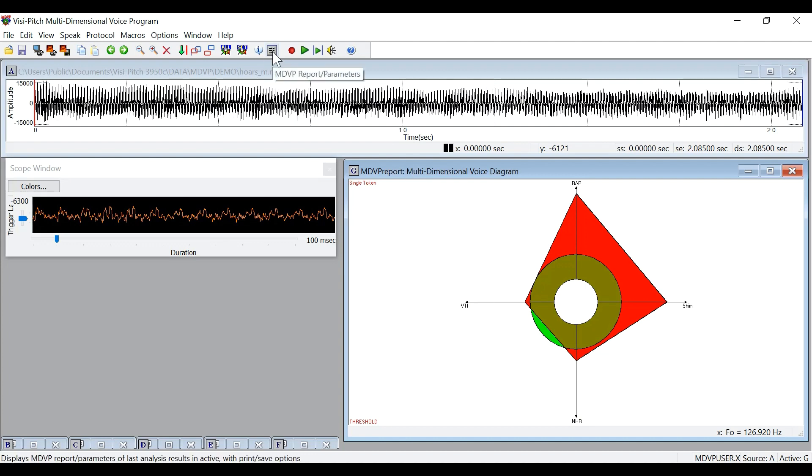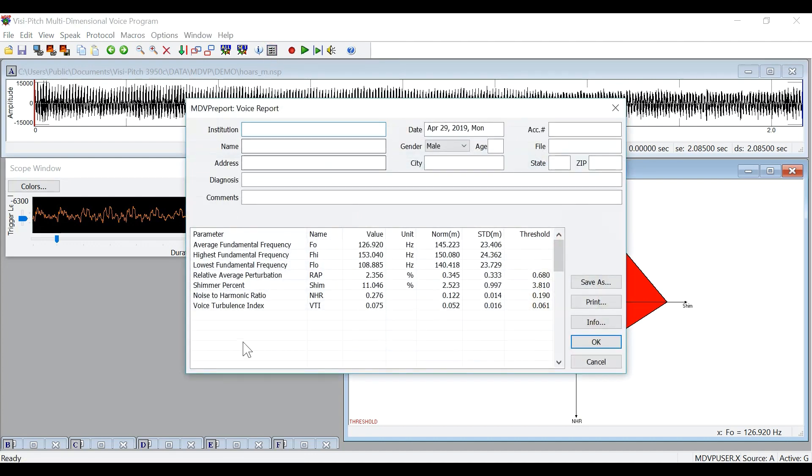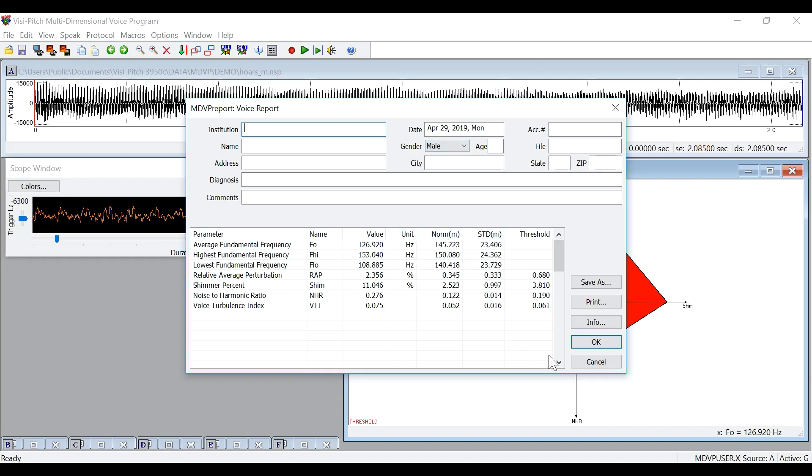You can then again generate the report and look at the values for the MDVP analysis, as well as some other values. Again, ensure that the right gender for the user is selected to see the correct normative data.